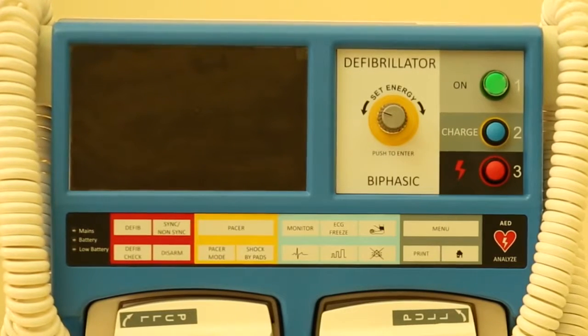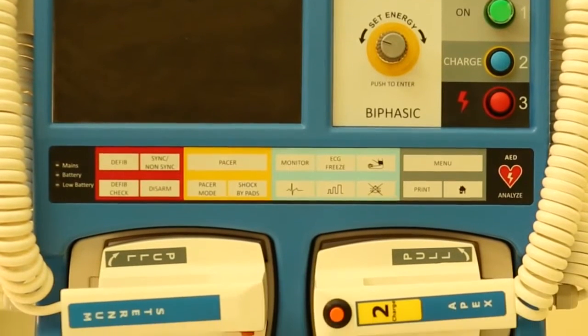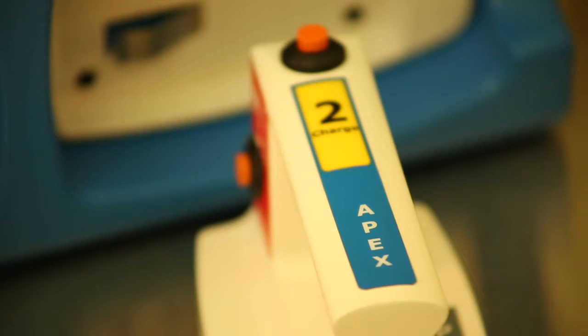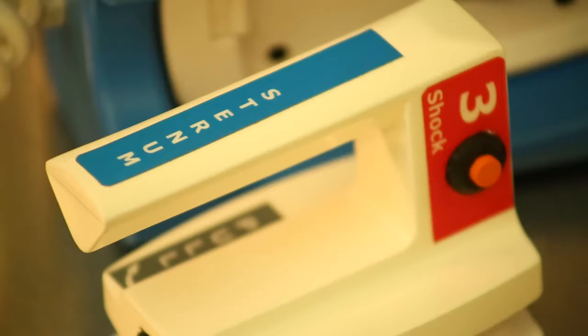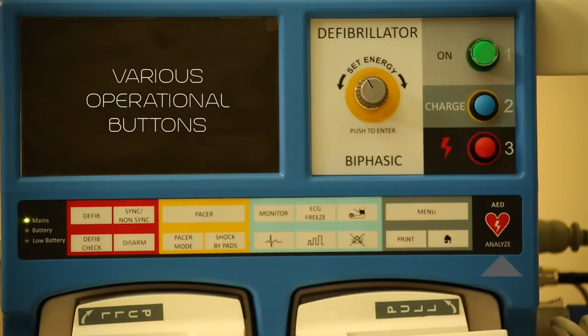The SANJEEVANI 1006 comes with a base unit along with two paddles attached to it, apex and the sternum. The apex paddle has two buttons, charge and discharge. The sternum paddle has only one discharge button. The front panel of the SANJEEVANI 1006 consists of the 7-inch display, an encoder and various operational buttons.